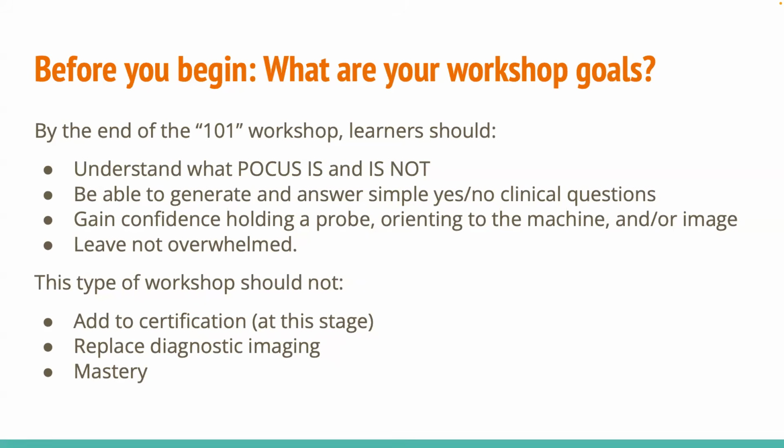It's a binary yes or no modality that answers discrete questions, and it does not replace diagnostic imaging. We want them to leave with that in mind, because we don't want them to think, well, I have these two sets of skills and I'm going to do an echo now. We want them to understand the scope of POCUS.